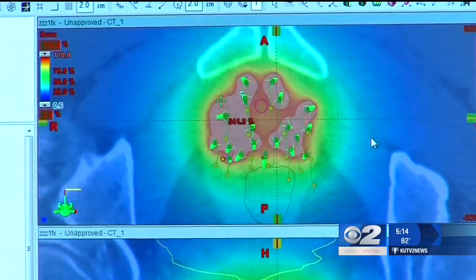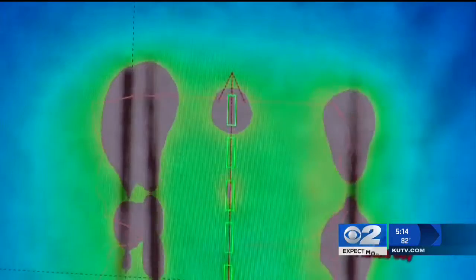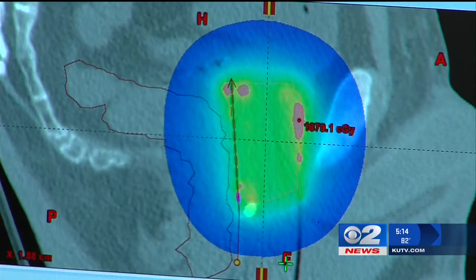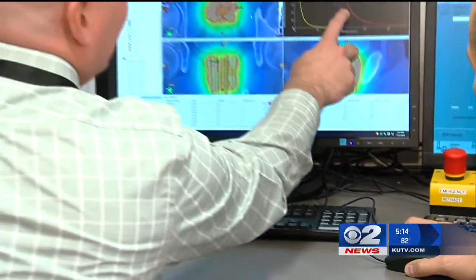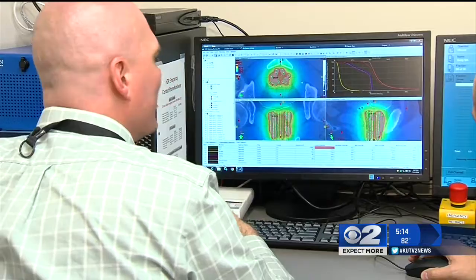With prostate cancer, for example, we will place needles into the patient's prostate, and that radiation source can be put into those needles. Not everyone is a candidate, though. This type of treatment can only be used on certain cancers. Typically, there are things that are fairly close to the surface of the body. Cancers generally good for brachytherapy include prostate cancer, some breast cancers, gynecologic cancers, and a few others.